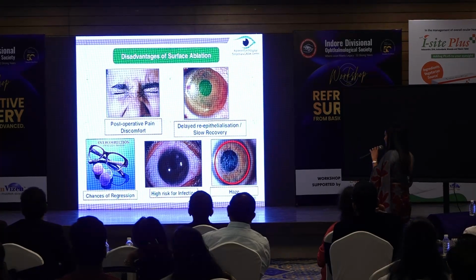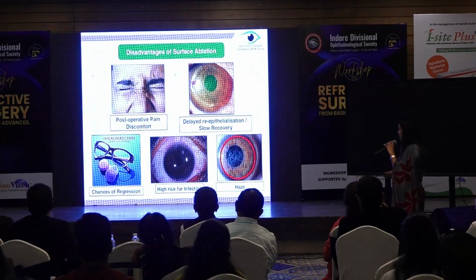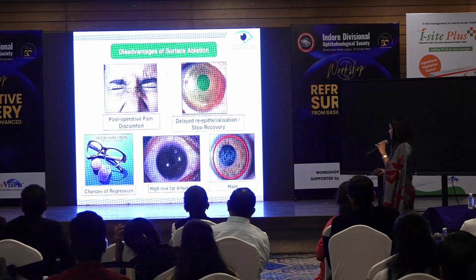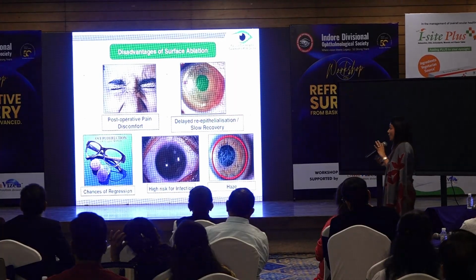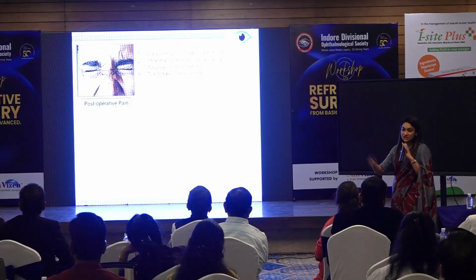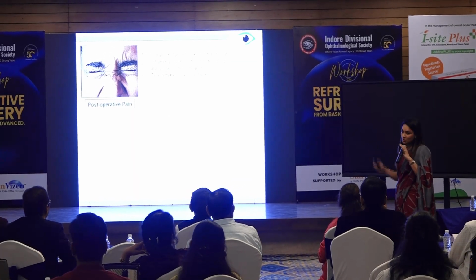We know that these patients usually complain of post-operative pain, there is delayed reepithelialization. Like we are saying, there are chances of regression, a higher risk of infection because we are removing the epithelium, and the most dreaded is post-PRK haze. How the advanced surface ablation is different from the traditional PRK is now what we are going to discuss.